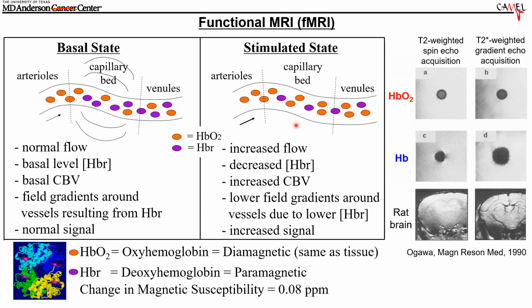So this increase in the oxyhemoglobin, decrease in the relative amount of deoxyhemoglobin, can actually be imaged with MRI because oxyhemoglobin is diamagnetic, it is not a very good MRI contrast agent, while the deoxyhemoglobin has iron that is not coupled to oxygen and therefore can be exposed to water and looks like a little magnet within the large magnetic field of the MRI.